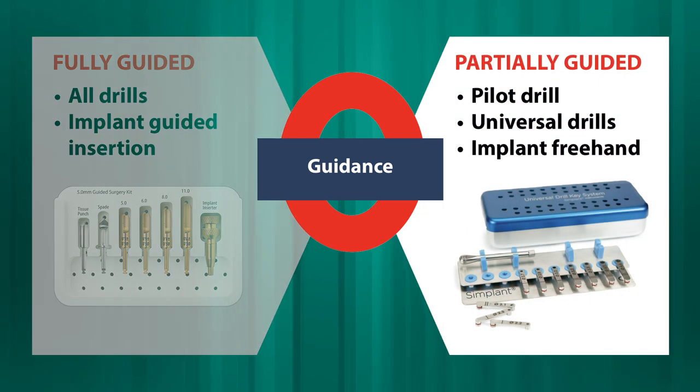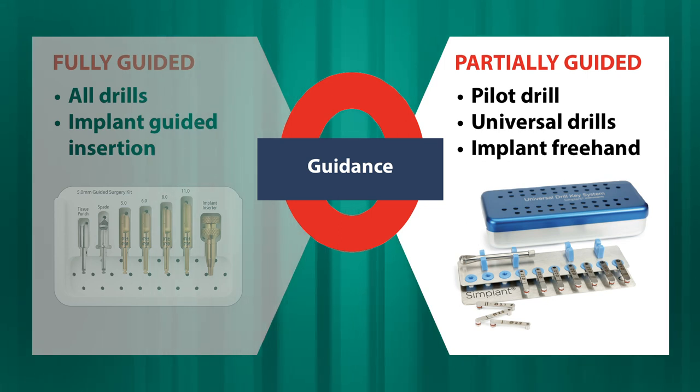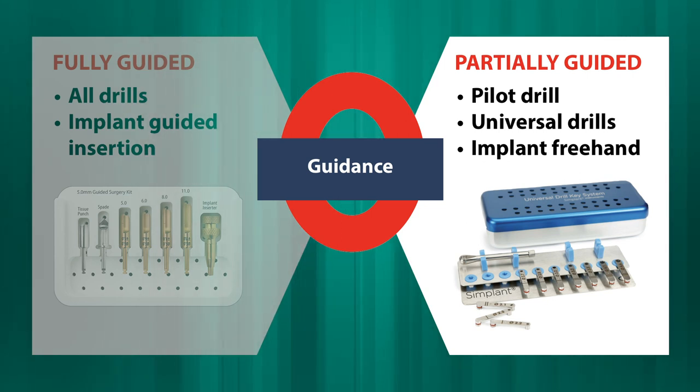In a partially guided protocol, we have two different variations, which are the pilot drill and universal drill approaches. In the pilot drill approach, we perform only the initial drilling using the pilot drill, while the guide has the corresponding pilot drill ring and sleeve, and then widening of the osteotomy is performed using the freehand kit till the implant insertion, which is also done freehand. In a universal drill protocol, drilling is performed using a universal drill kit up to the drill before the last one, and then the last drill is performed freehand using the freehand surgical kit of the corresponding implant system.